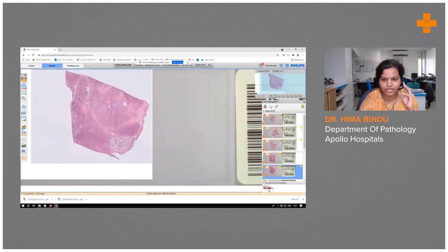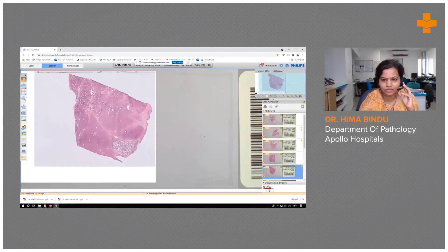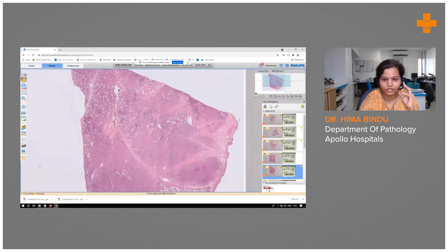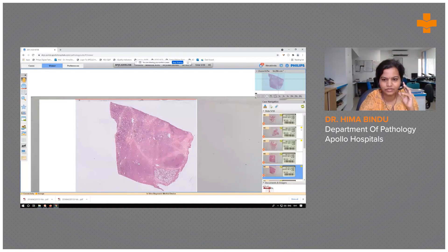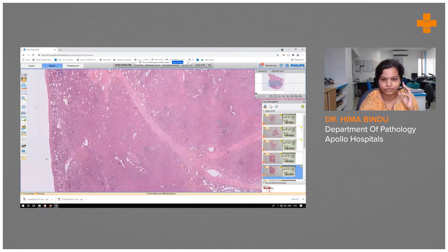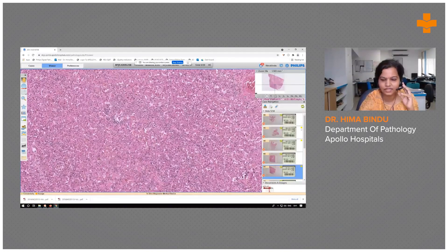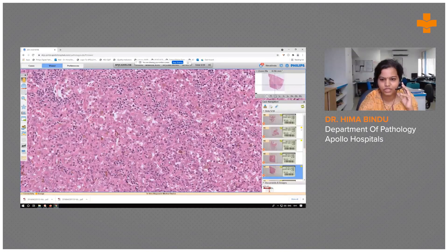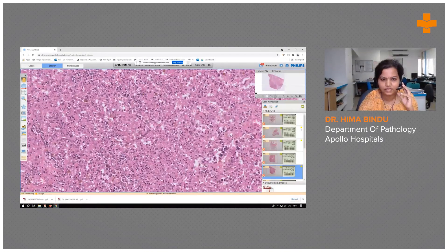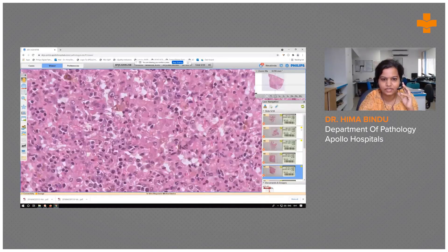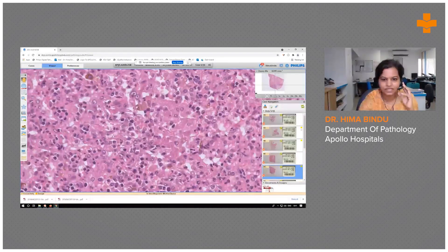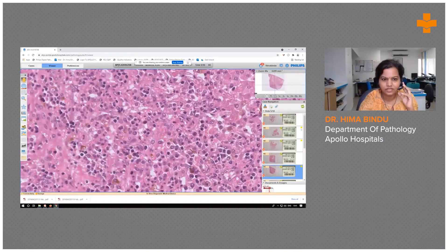The firmer areas of the lung parenchyma showed dense inflammation on low power view. Higher power view showed obliteration of the alveolar spaces and the interstitium as well. The dense inflammation was composed of neutrophils, lymphocytes, plasma cells, and macrophages, including pigment-laden macrophages.